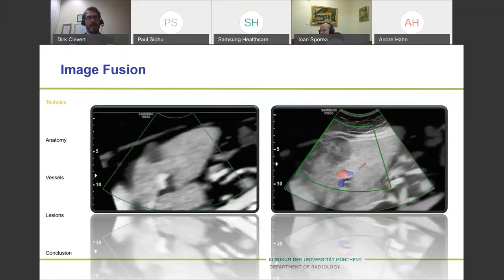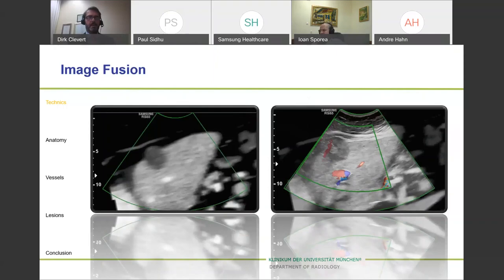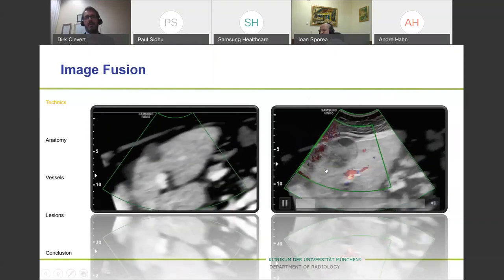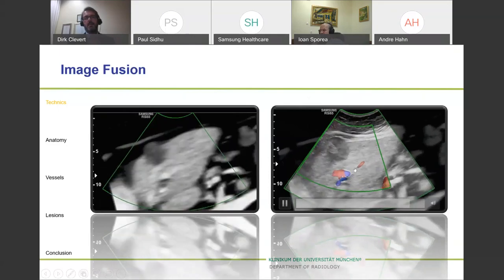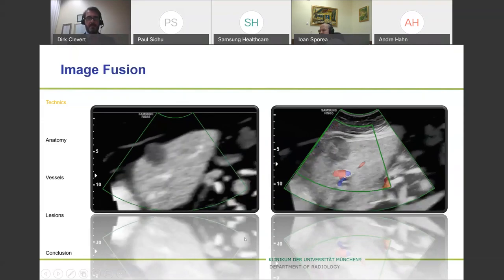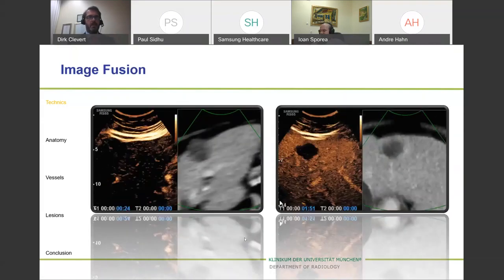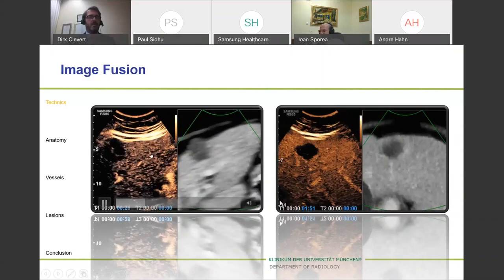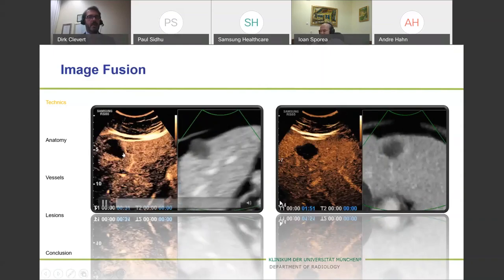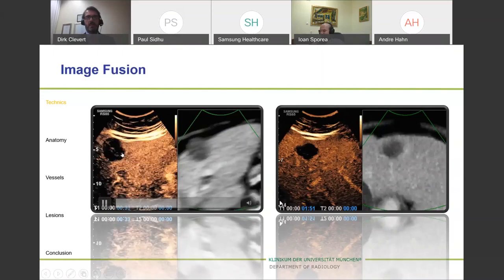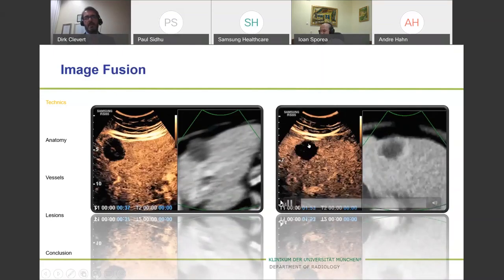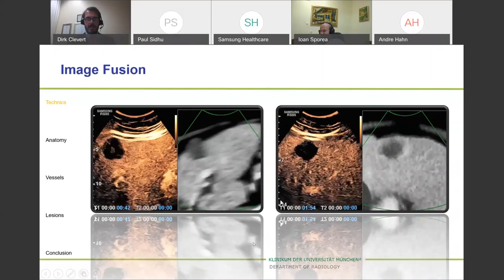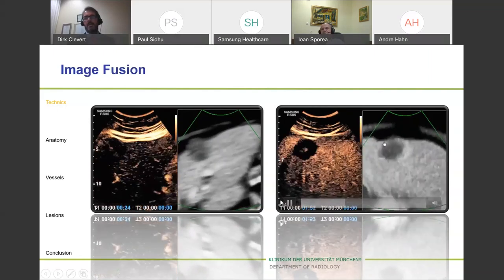There is an overlay technique where you see the lesion detected on the CT, and here you have the overlay with color Doppler and grayscale in the area where the same lesion is seen on CT. You can also switch on contrast — as seen here, this lesion was treated. There is less enhancement, and most of the area shows no enhancement, indicating successful treatment. In the later phase, there is no major enhancement, or just a little in the middle — confirming successful treatment of a liver mass, also confirmed by the CT information.